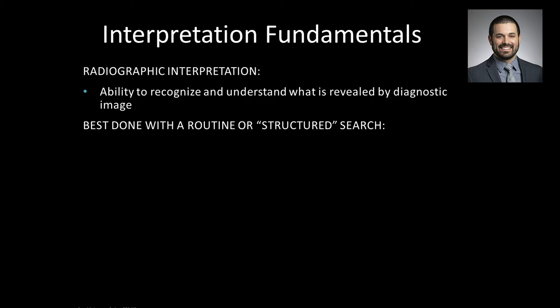Then once I'm done with that and comfortable with having reviewed everything, I will reconstruct the PAN. It takes just a few seconds, and I will count all the teeth, making sure there's nothing missing and nothing extra. Then I go tooth by tooth and evaluate dental pathology. Based on my findings and earlier views, I may do specific TMJ scan images to evaluate the joints. That's my structured search.